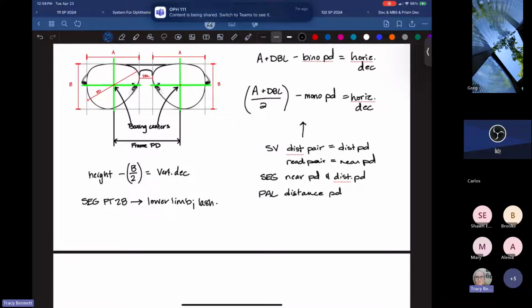All right, and flat top 7/28, which would be a trifocal. We take that at the lower pupil margin, right? Pupil minus 1. Minus 1 for that clearance. And then a progressive, where do we take a progressive? Dead center, pupil center. Very good. All right, good.